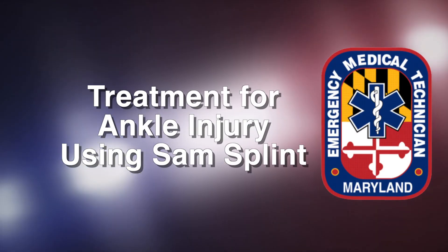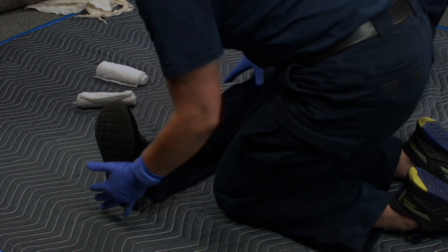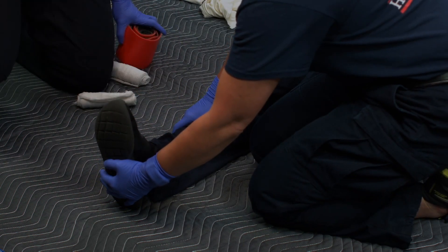For the treatment of an ankle injury using a SAM splint, the first provider will maintain stabilization holding the bottom of the foot and behind the ankle. The second provider will assess circulation, motor, and sensory.